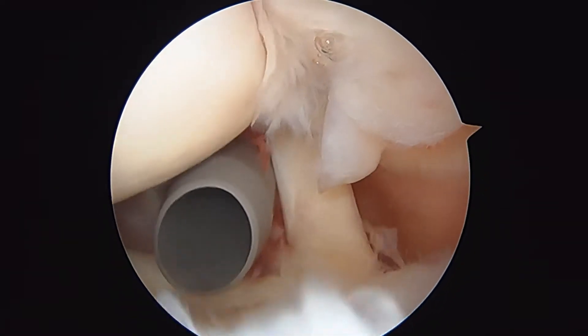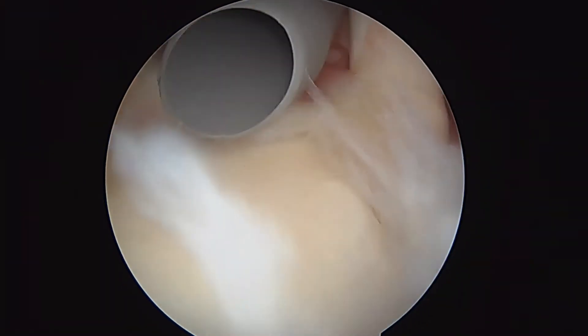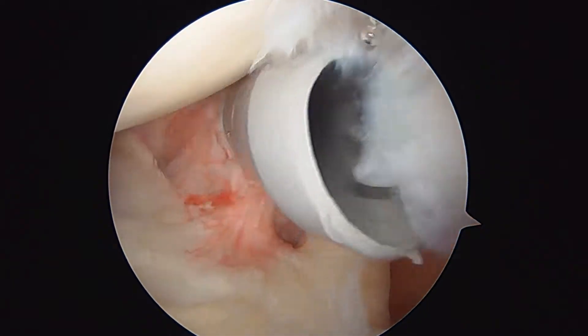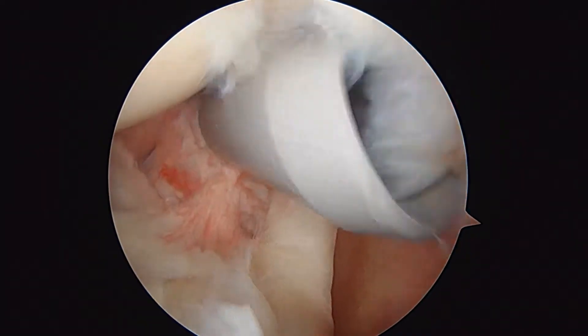You're laying on your side, just to orient you. The ball part of the ball and socket joint is at the top of the screen, the glenoid or the socket is down below here. Your biceps tendon is this strong cord-like structure here. It's difficult to see the biceps because this torn rotator cuff is hanging down right in front of it. There's the torn rotator cuff right there.